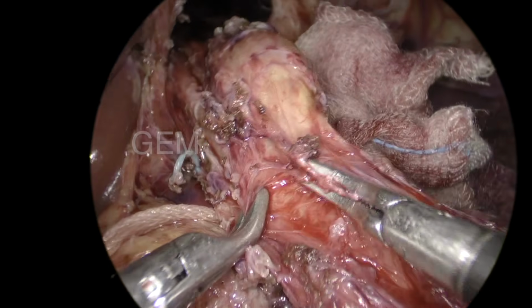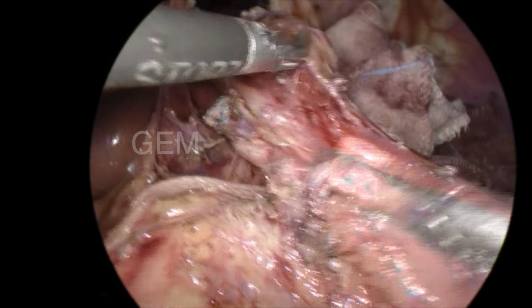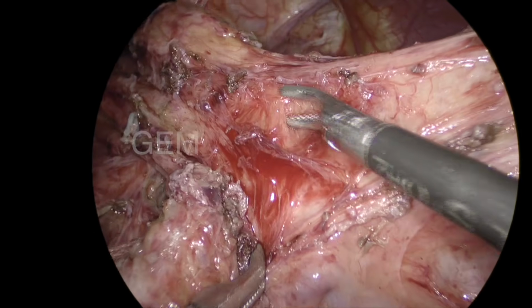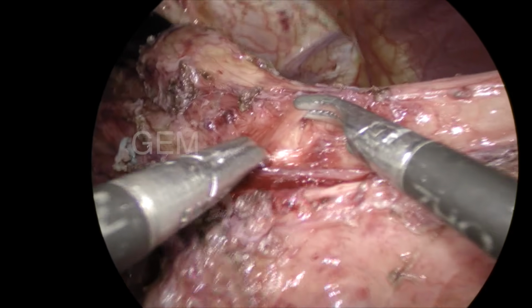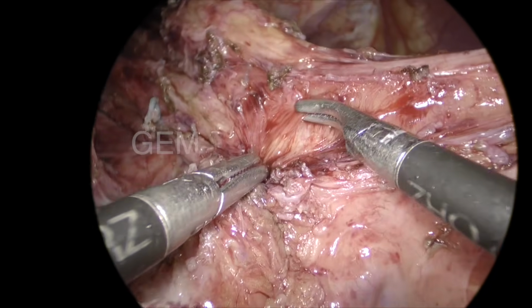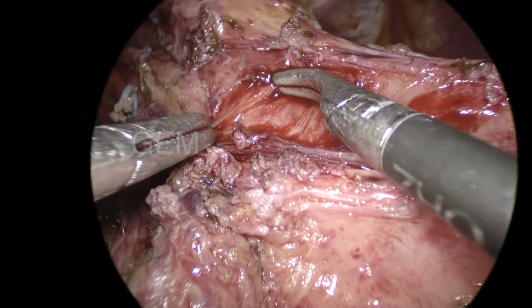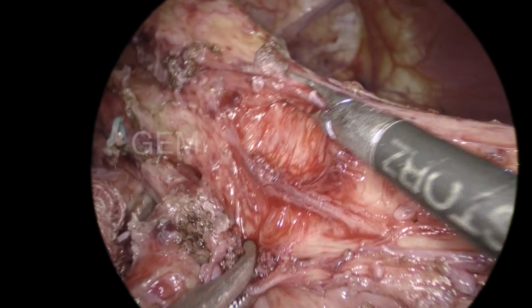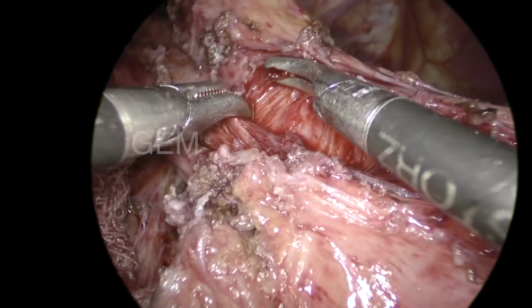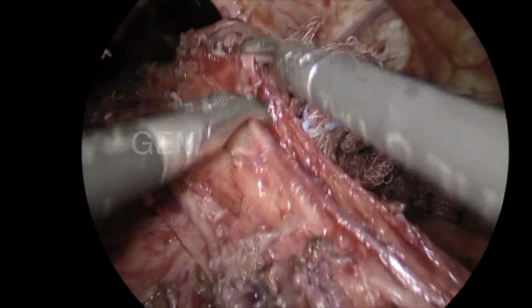That's why perioperative endoscopy will be helpful. Always do it in a difficult case and in a redo case. I don't do it in a regular normal Hellers. If I see the muscle very confidently, divide the muscle, and the mucosa bulges out, then I don't normally do the endoscopy. Now you can see the muscle is there. The endoscopy gave me the confidence, so that I went one layer down, and I could see the mucosa. So I'm dividing the muscle fiber by fiber. I will be able to see the mucosa.